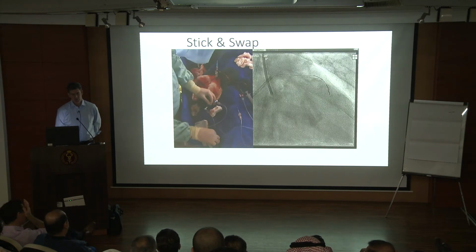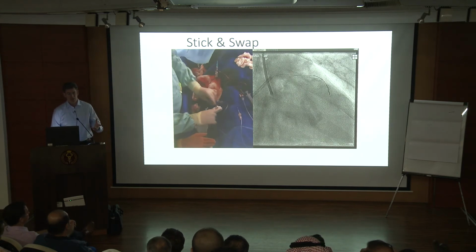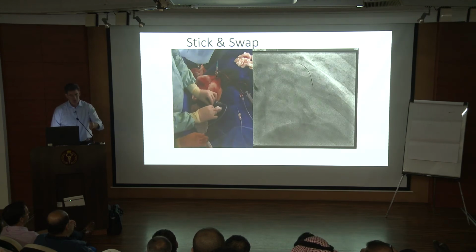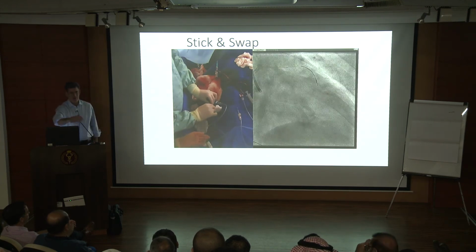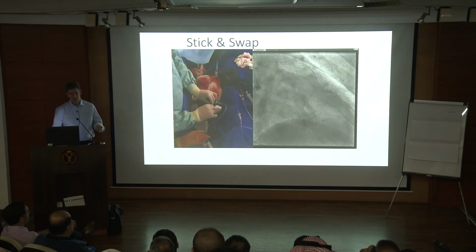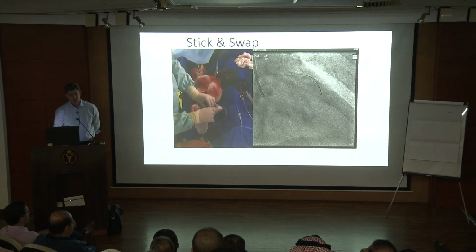I mean, these are small micro movements. We've got predictable behavior of the wire. We know what the wire looks like when it's stuck in the space. We can see it wrapping round. But there is a degree of tactile feedback and visual feedback, and I think you just have to do it.